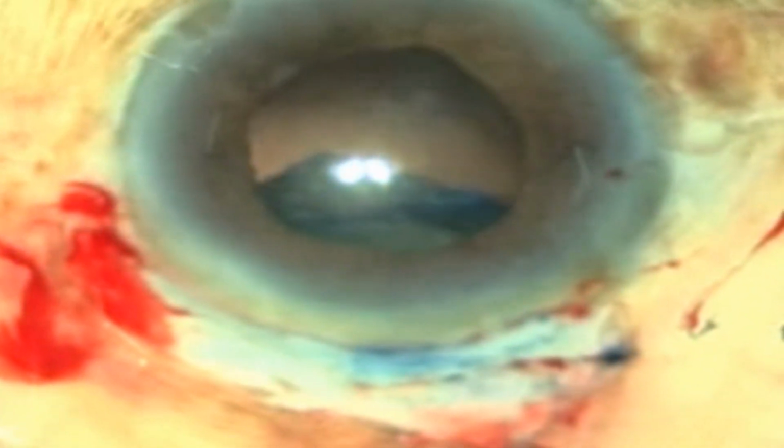In this case, a posterior assisted levitation or PAL, the nucleus is retrieved through a pars plana sclerotomy, introducing a rod through the pars plana and levitating the nucleus up into the anterior chamber. This is called the posterior assisted levitation, PAL, wherein the entire nucleus is brought up into the anterior chamber and delivered by enlarging the limbal incision.